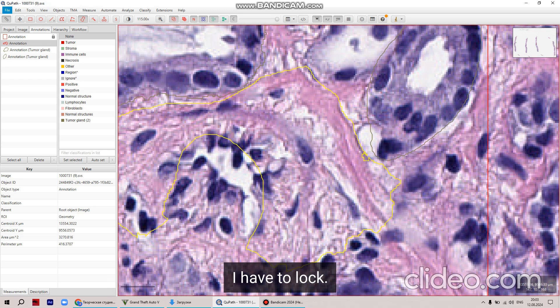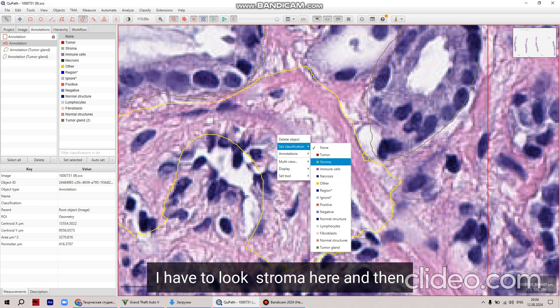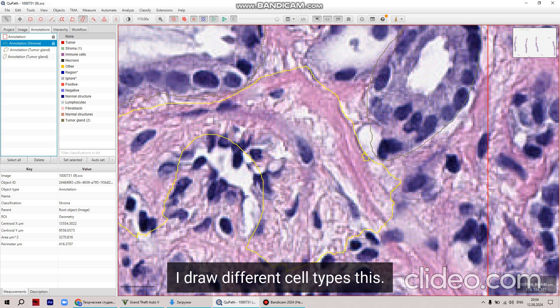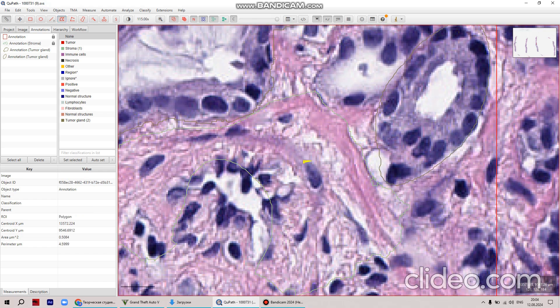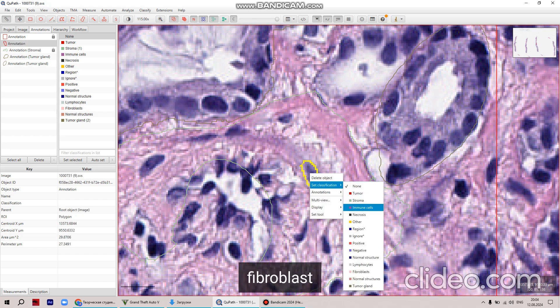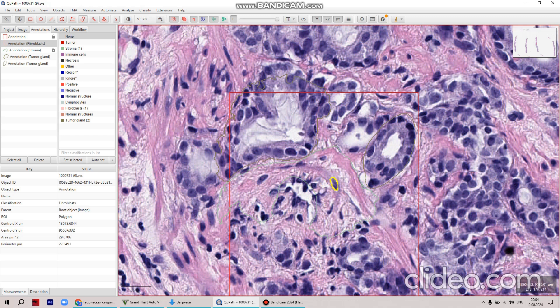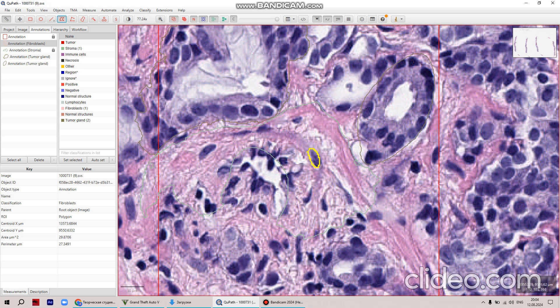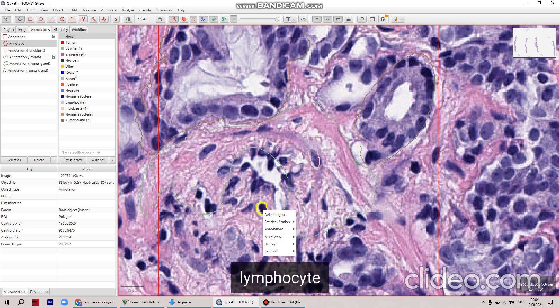You could zoom in and out, start playing with the mouse, and see the overall structures. Then you choose the area of your professional interest — you could choose area wherever you want, the area where you will do your annotation.